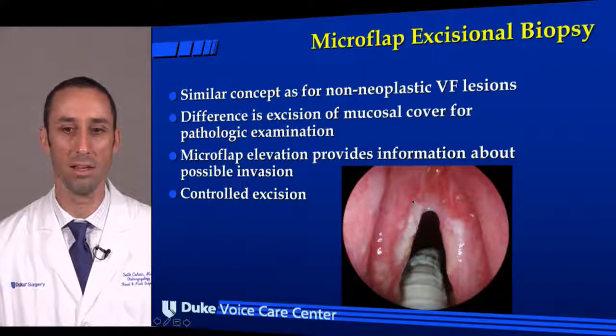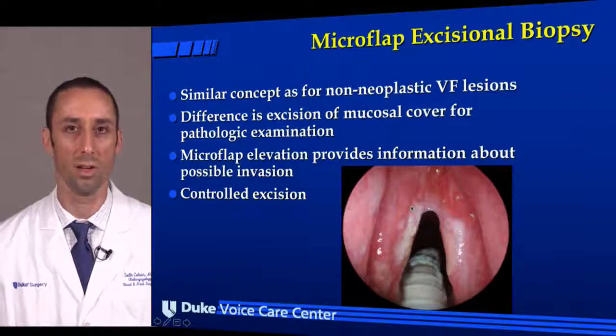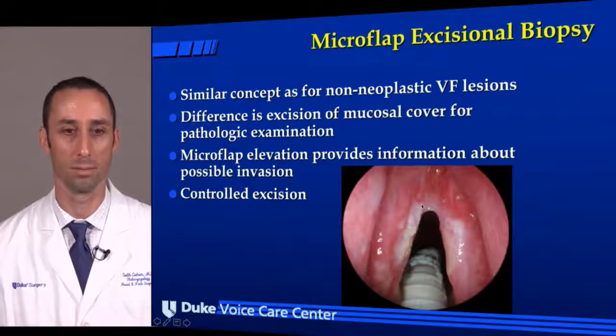So what you can do is make an incision lateral to the lesion, and this is going to be more scarred than in the prior examples because of its prior surgery. You can get your elevators and your scissors, and you can get a sense as you're dissecting whether this is stuck, how scarred it is, do you need to make it a deeper plane, but you can remove this whole lesion and then have a complete pathologic evaluation of this lesion.